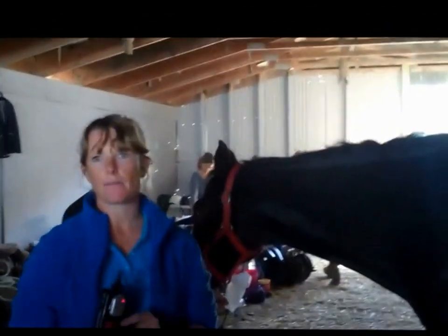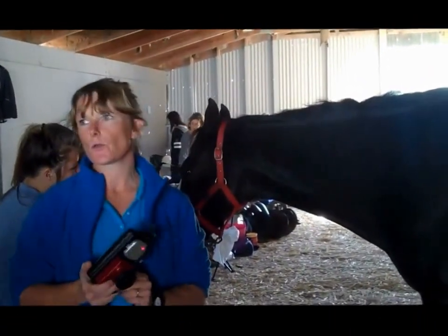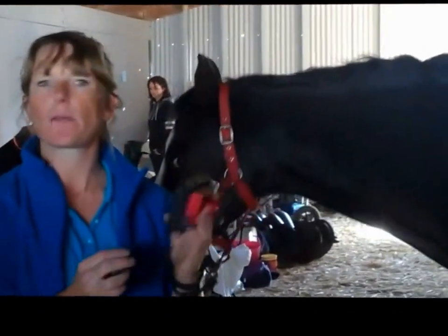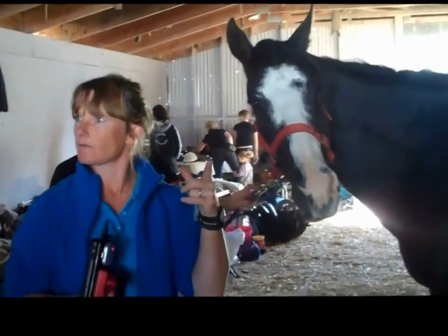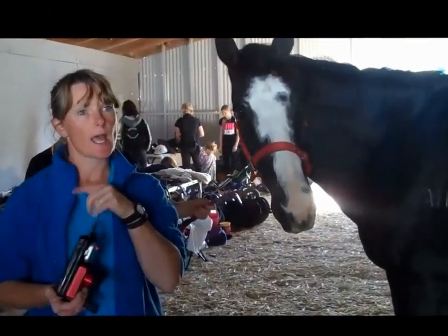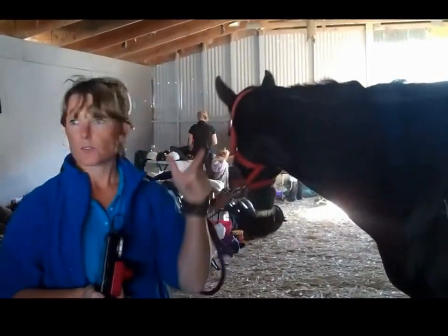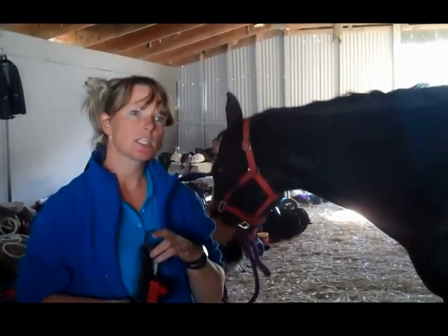I'm Rachel Harford and I've come today just to do a thermal imaging demonstration. What I have is a thermal imaging camera — it's a really small camera — and what it does is it reads the reflected heat from the horse or the people. Basically I can shine the camera at the horse and you can see hot spots, cold spots, and interactions or disruptions in circulation.